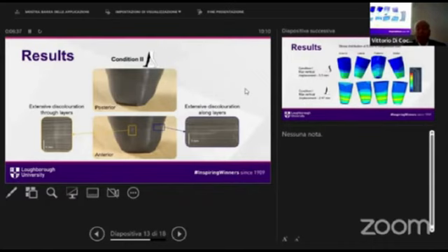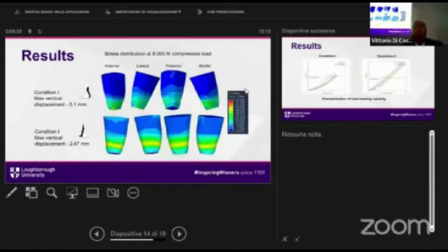But the important point is that all this was obtained for the significantly higher levels of the loads that are supposed to be achieved in this. Also, just for you to understand how it is considered, the standard foresees a 5-fold weight, which is supposed to be carried by a single socket. So practically, it's a factor of 10, because usually, as you can assume, in standing, only your weight is divided by 2. But when you are going, in this case, it's supposed to be 5 times higher.